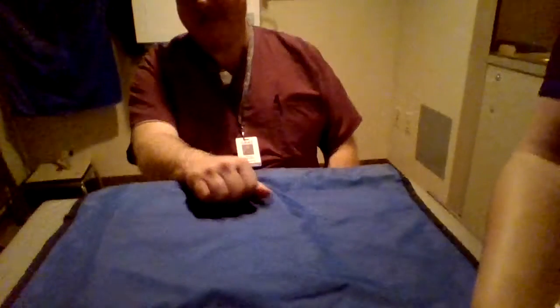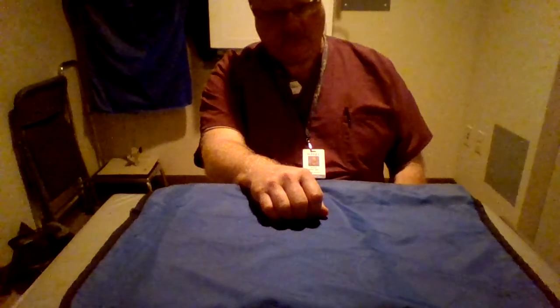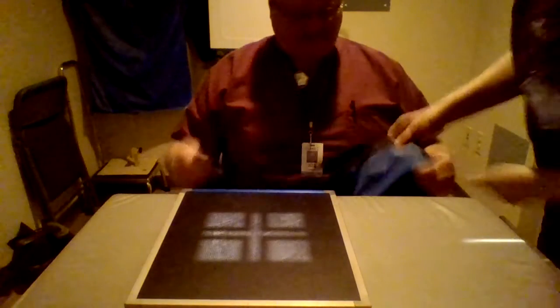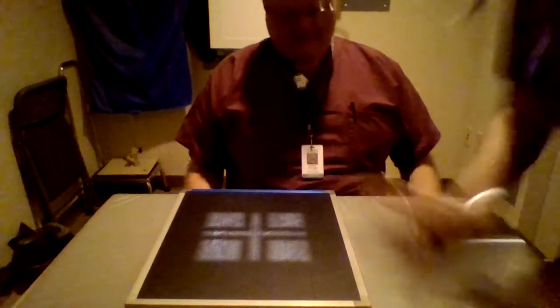Okay, and can you tell me what's been going on with that wrist? It just hurts. It's been hurting for about 2 weeks now. Okay, did you fall or have any trauma on that wrist? No. Okay, so we're going to start out by placing the patient at the end of the table. I'm going to put lead on the patient's lap to protect their gonadal region.